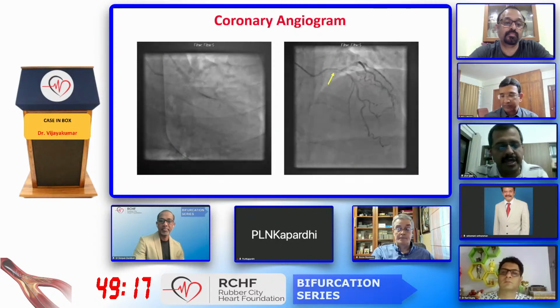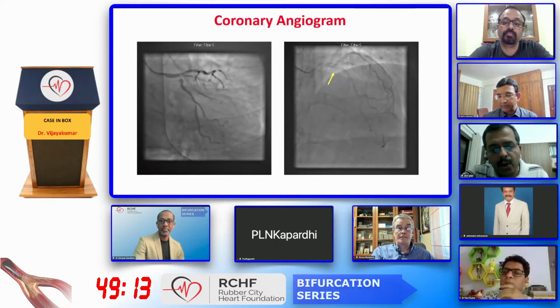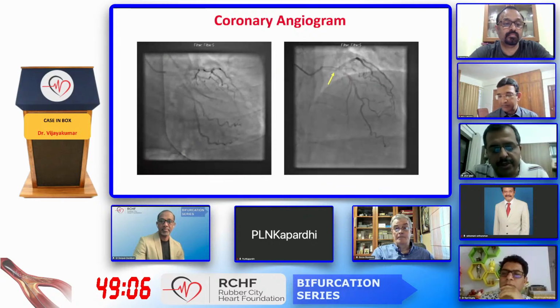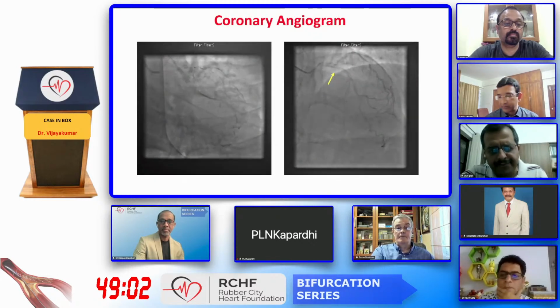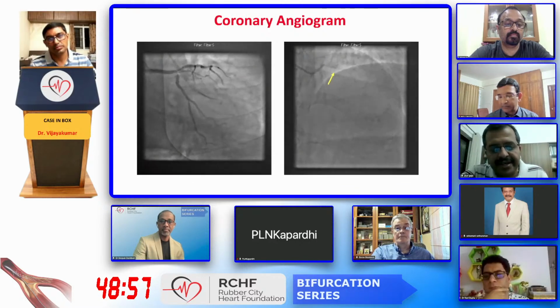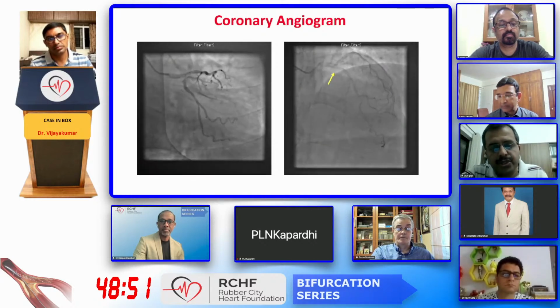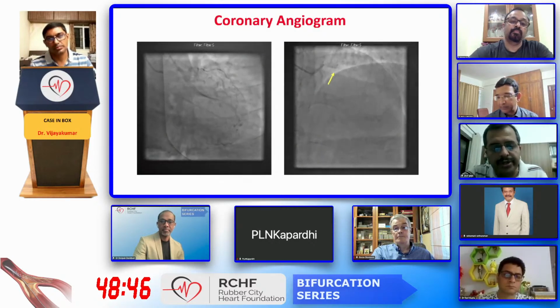As Madhu sir said, with either an FFR or imaging, reassess the LAD ostium after you have done a good, well-expanded stent from LM to LCX, with a good preparation of the ostial circ with a cutting balloon and a good post-dilation after stenting. Reassess the ostium of the LAD with an FFR along with imaging, preferably an OCT, to look whether the struts are across the LAD ostium, and then take a call on whether to intervene on the LAD or not.